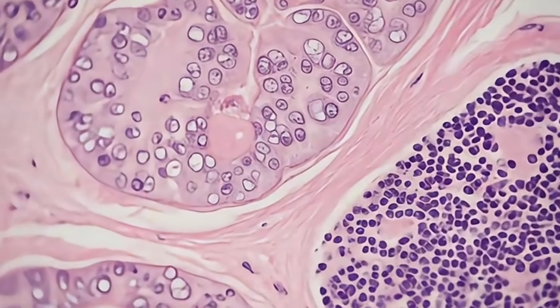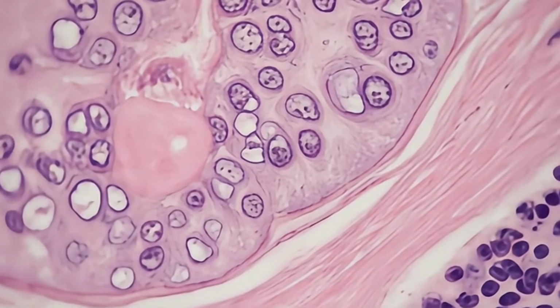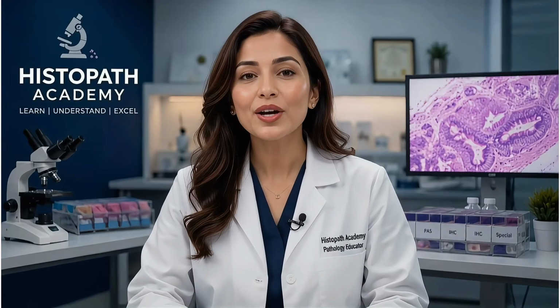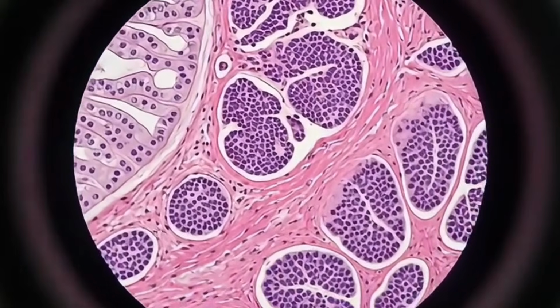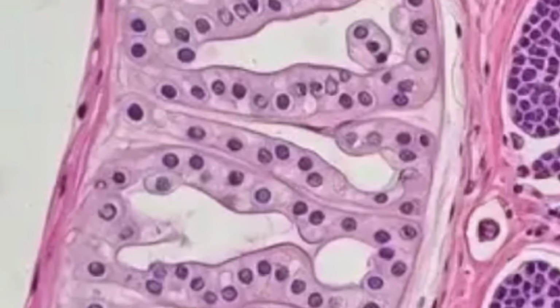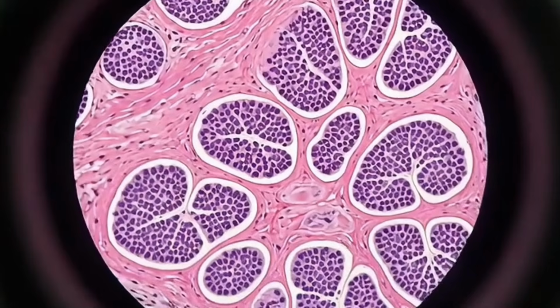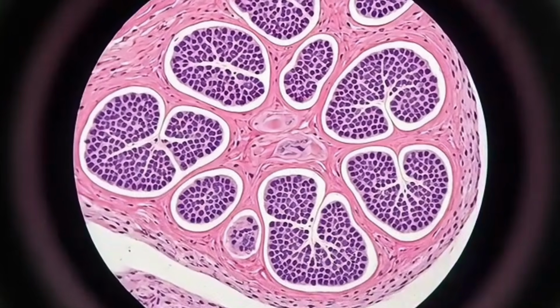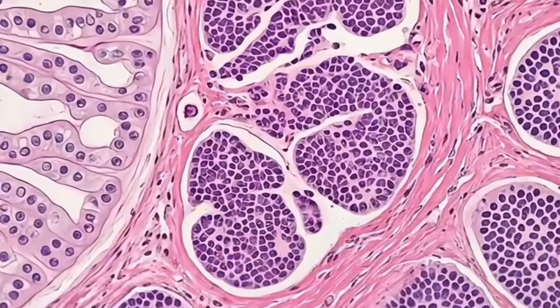Now, let's do what every pathologist does before making a diagnosis. Let's look at the biopsy under the microscope. At low magnification, we are not looking at individual cells yet. We're looking at the overall picture. Can you spot the difference? On one side, the normal breast tissue still has its natural architecture, but on the other side, something looks very different. Instead of smooth, well-organized ducts, we see irregular structures spreading into the surrounding tissue.